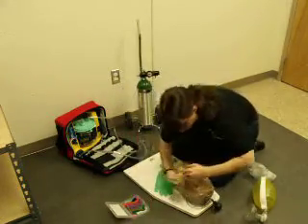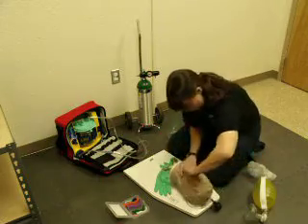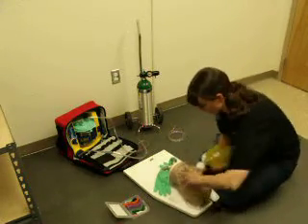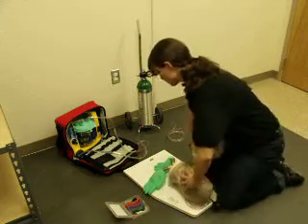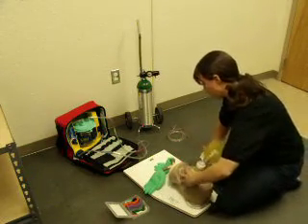I'm going to insert an OPA. You get no gag reflex. And then I am going to ventilate the patient — one breath every five seconds, watching for adequate chest rise and fall.